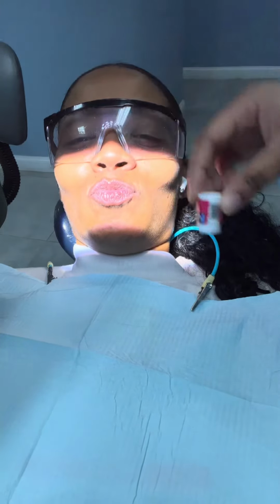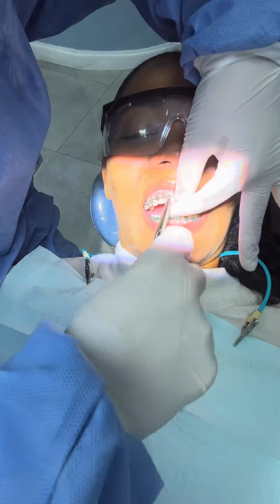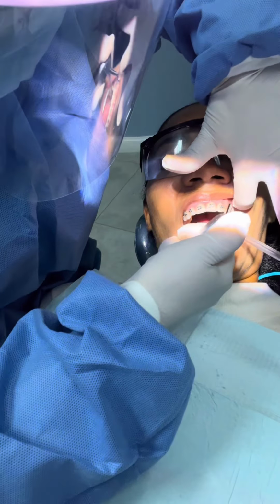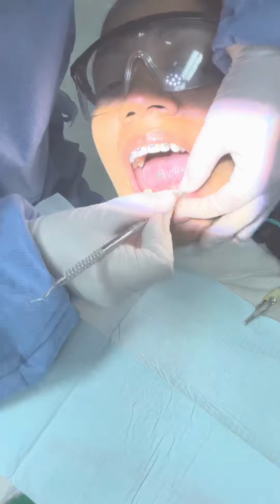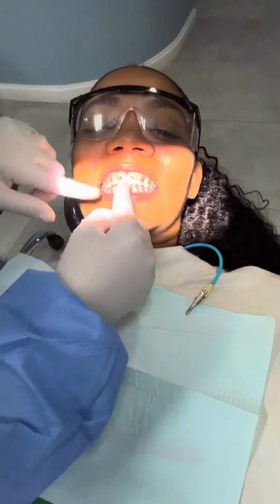Gotta put on a little chapstick, because your lips might get dry since your mouth is open for so long. First, she unwinds the inner wire because you gotta take that out. I felt such relief. Here she is washing off the teeth. Then she moved to the bottom row, removing all the old elastic. After everything is off and my teeth are clean, she checks them to make sure they're aligning and moving in the proper direction she wants them.